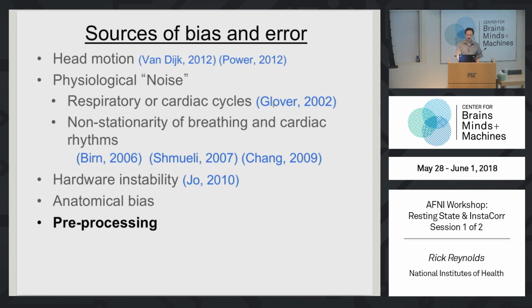Respiration and cardiac cycles, with Glover, a lot of stuff, non-stationarity of those. Non-stationarity is a concern overall. I mean, for example, you do bandpass to remove sinusoids at some frequencies. But of course, bold responses, even if they tend to be dominated in some frequency, will span all the frequencies. And they happen whenever. They're irregular, so they're not stationary either. So there are a lot of little concerns, but on top of all these concerns, it still seems to work fairly well. So that's nice.